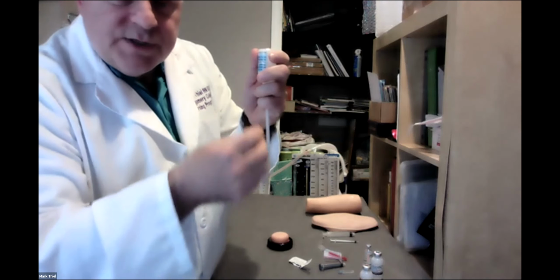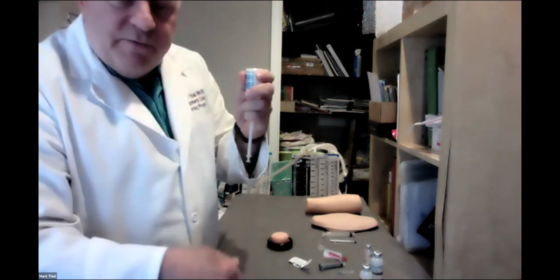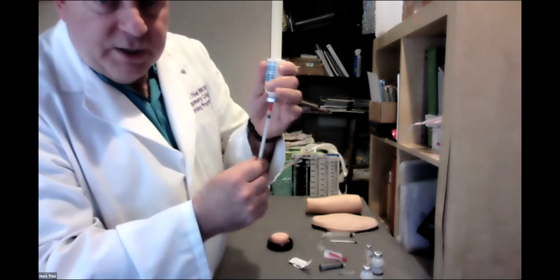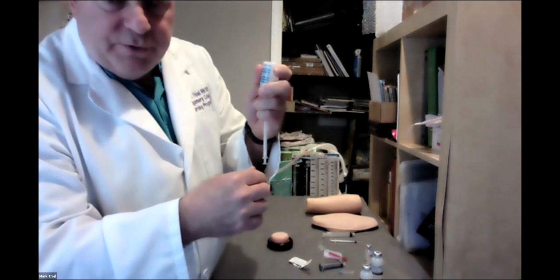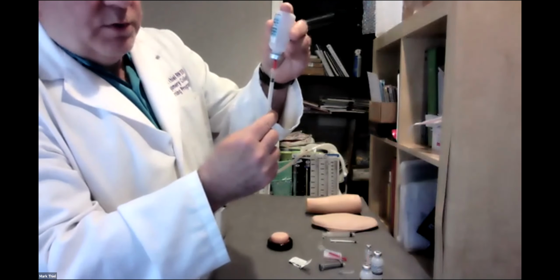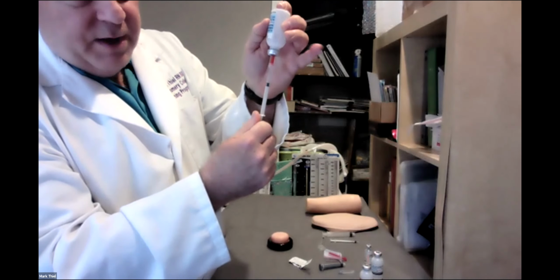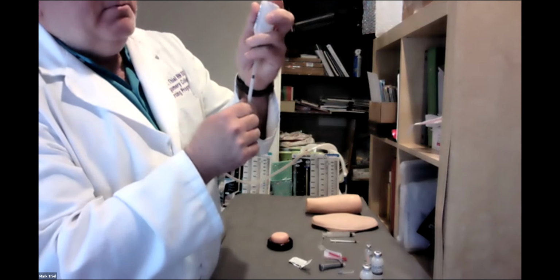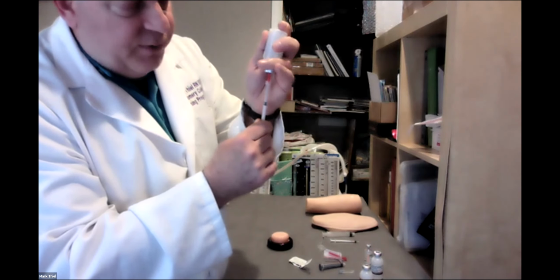The reason we're doing that is if many nurses came in and drew 0.5 mLs, they would create a vacuum within the vial. Therefore, we're putting a little air in to prevent the vacuum and to enable the medication to pump out. Once I have pushed the air in, now I draw to my 0.5, holding it in my hand, halfway down the syringe. Now I have my syringe filled with the medication.